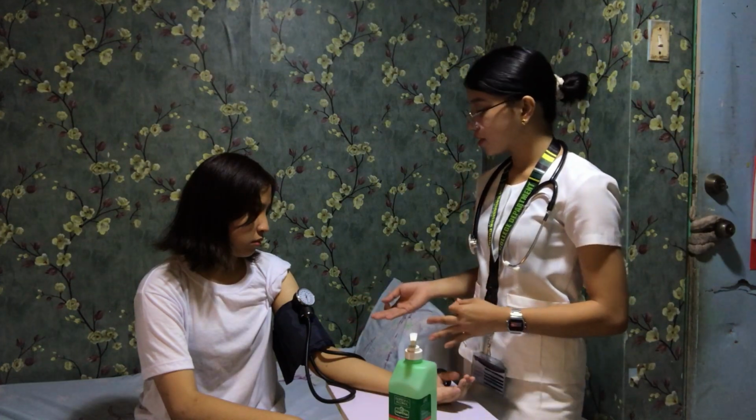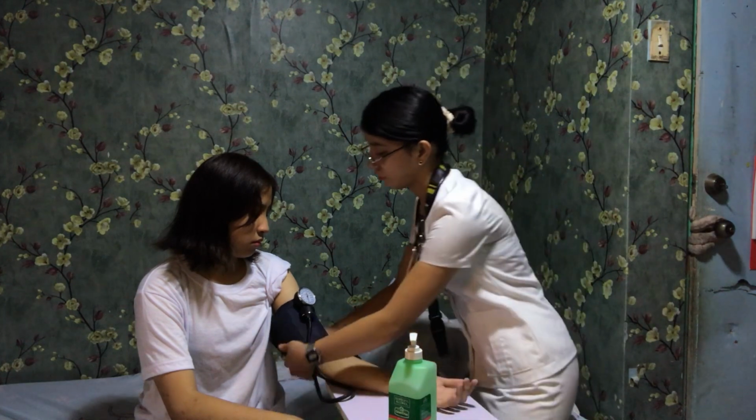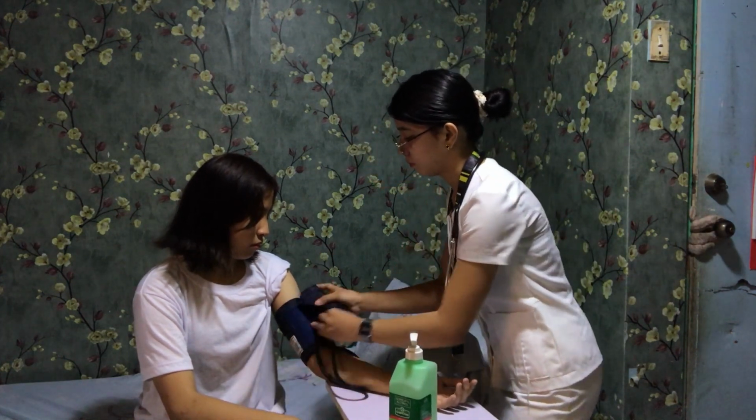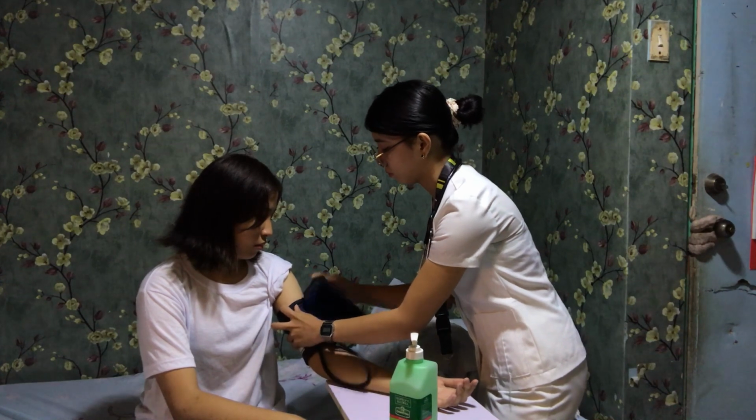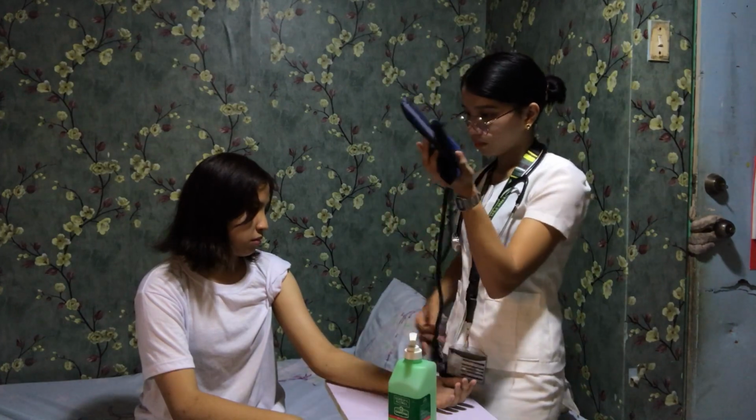Since this is my patient's initial examination, now I'm going to do the procedure again on her other arm. For the actual taking of the blood pressure, I need to inflate the cuff about 30 millimeters of mercury higher than the estimated systolic pressure. For the actual procedure, I'm going to need my stethoscope.